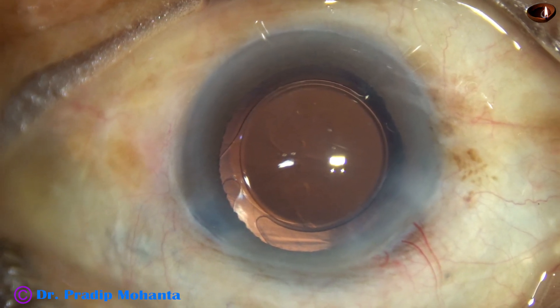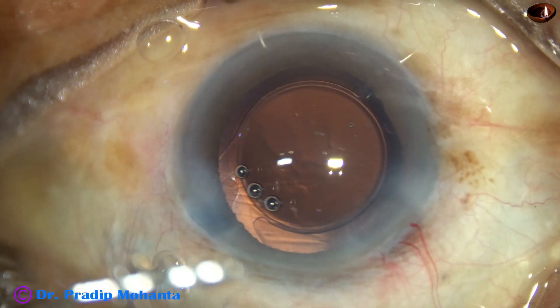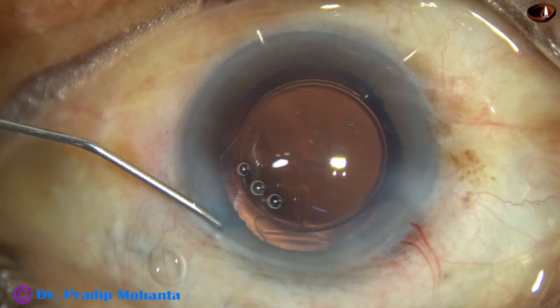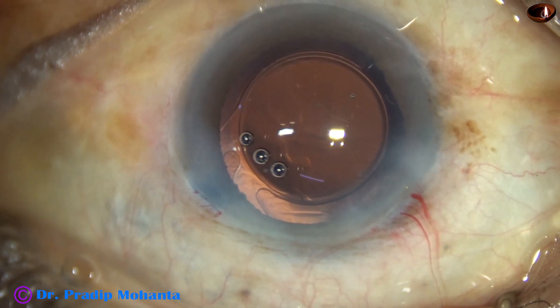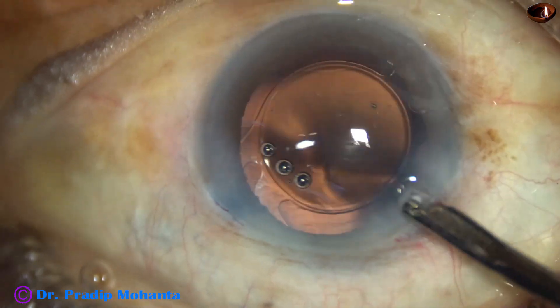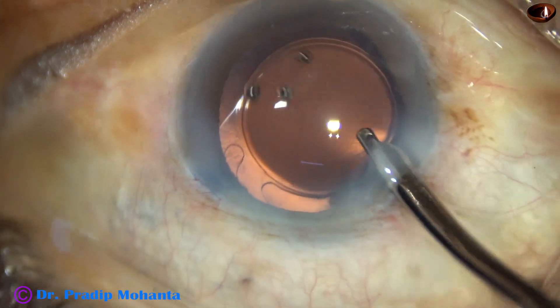This is a bit of moxifloxacin. The side port is closed by hydrating the corneal stroma on either side of the incision. The main wound has been constructed as a self-sealing wound — it does not require any hydration.